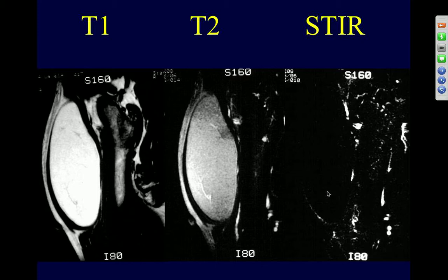And a lot of people who have these lipomas can have literally hundreds on their body. It's really pretty common. And very early on, we realized that there are some major advantages of MR in looking at these. One is we can really see the entire lesion with MR. We can also determine whether there's fat suppression through the entire lesion. And you don't get sampling errors with MR because of that. And it's turned out that MR has been very reliable: when they have benign characteristics, you can confidently state that it's a benign lipoma.